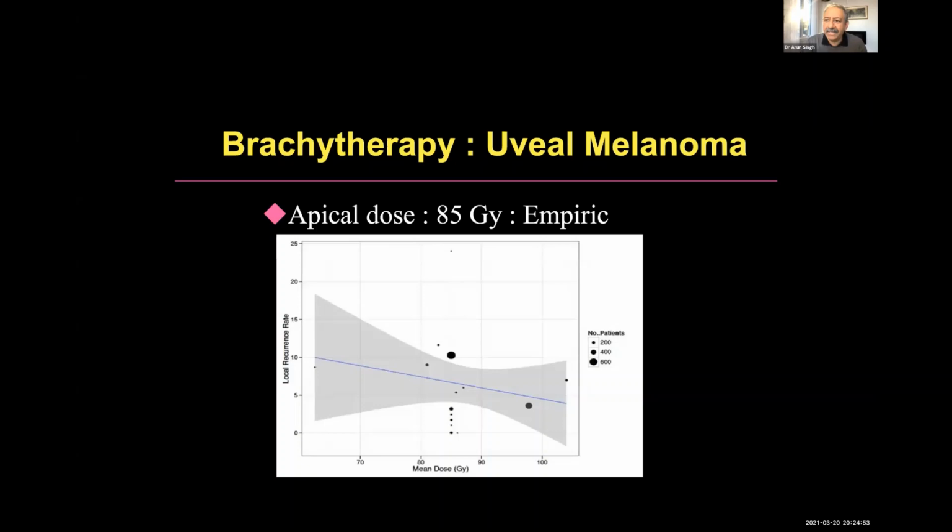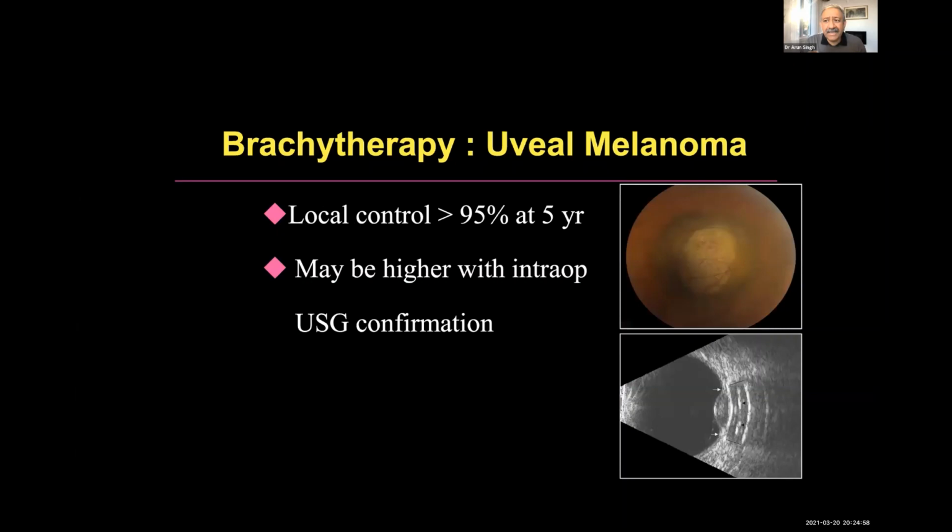And the last thing I want to talk about is that when doing brachytherapy, we do intraoperative B-scan ultrasound to confirm the placement of the plaque. I think that will improve your control rate, will reduce your recurrences because you are confirming where you are when you're putting in the brachytherapy.